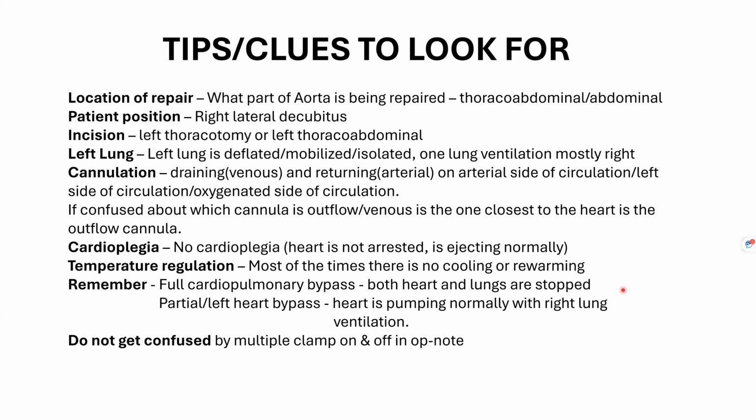The next important thing is cardioplegia, because you do not want to arrest the heart. So there will be no documentation of cardioplegia being given. The heart will be beating normally. Temperature regulation: most of the time there is no cooling or rewarming done, unless it's a very long case and they want to selectively cool the visceral organs. They can do it, and then it will be documented like that.